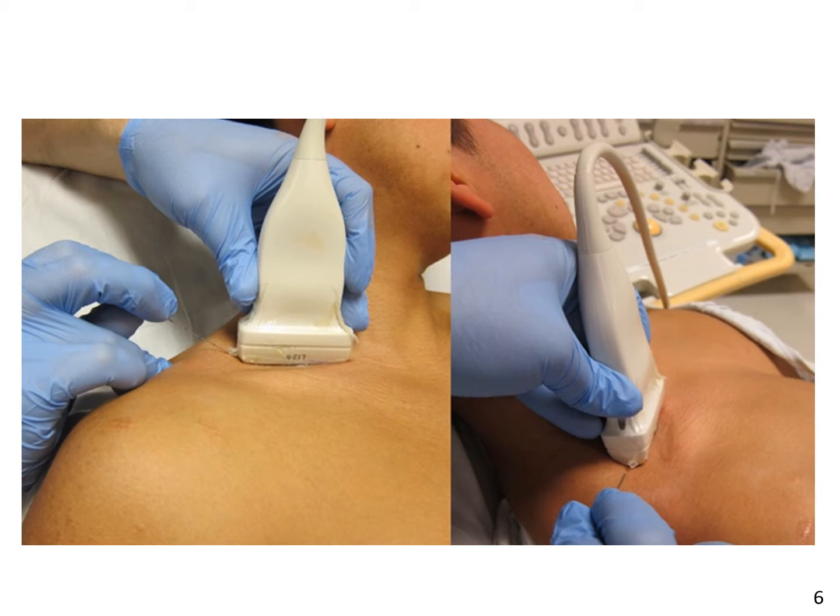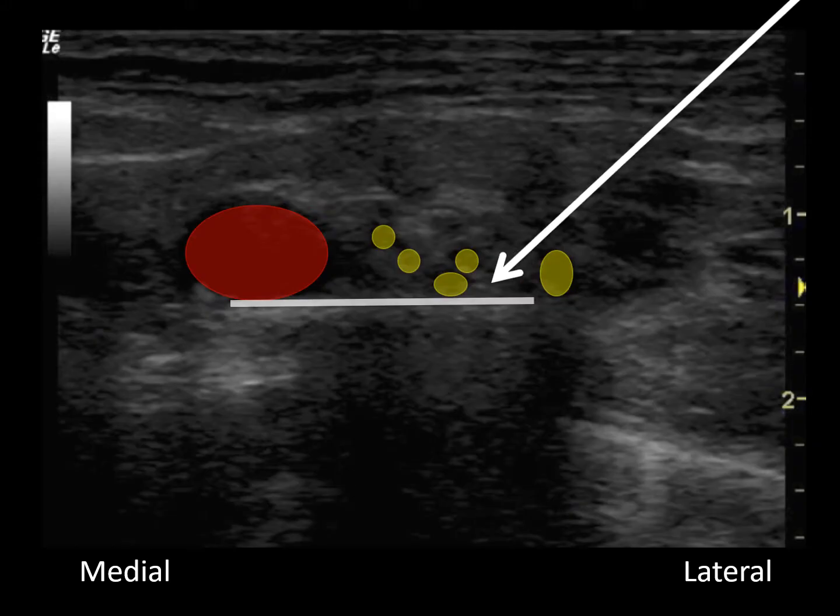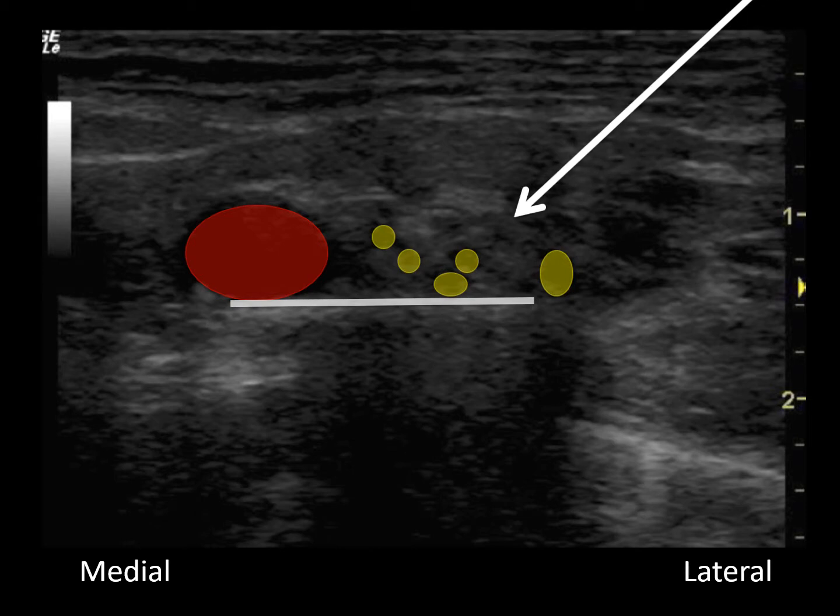This technique is easiest to perform if you are standing behind the patient with the ultrasound machine opposite to you. The needle is inserted just lateral to the edge of the probe and advanced from lateral to medial using the in-plane technique. The needle is advanced, aiming the needle tip toward the space just superficial to the first rib, which is outlined in white here.